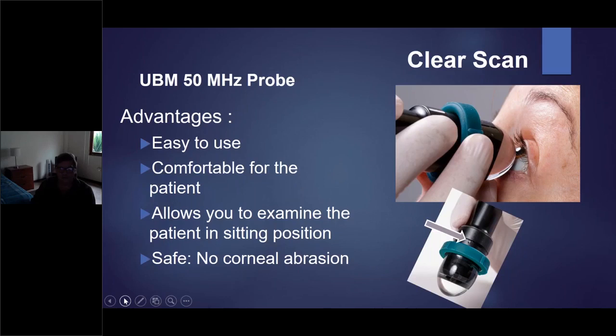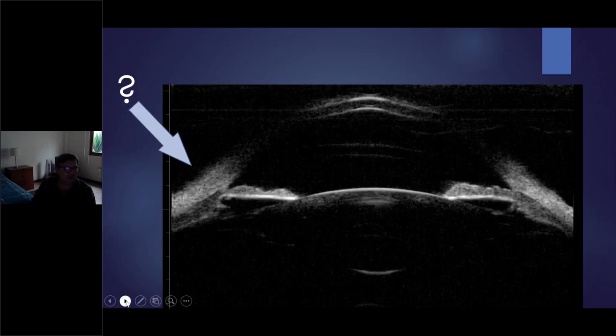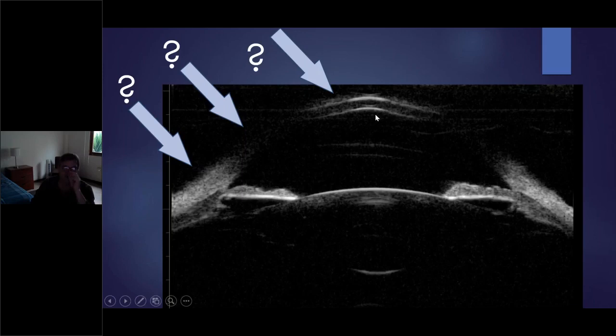Look at this, very clear. Then the second is not so clear. The new probe, this is the old 50 megahertz, from last year. The new one is much better because of a correction of this and enhanced signal in the area. And then again, you have a very nice picture of the apex of the cornea. Why?